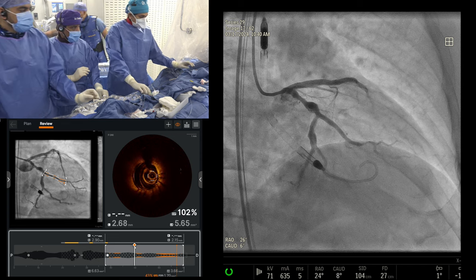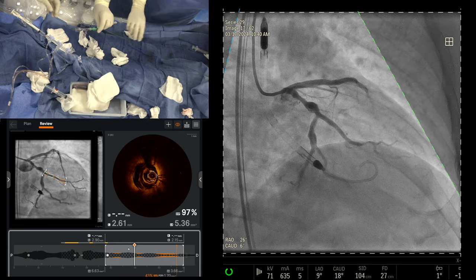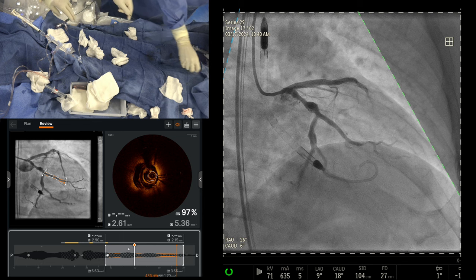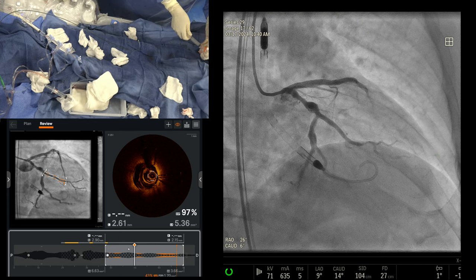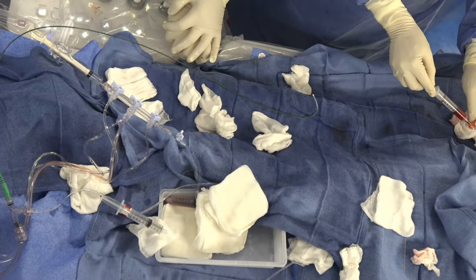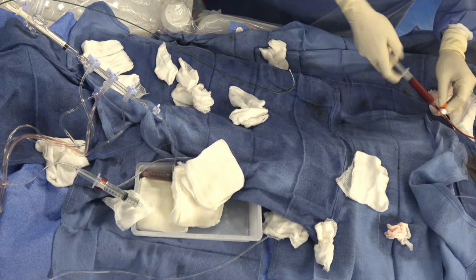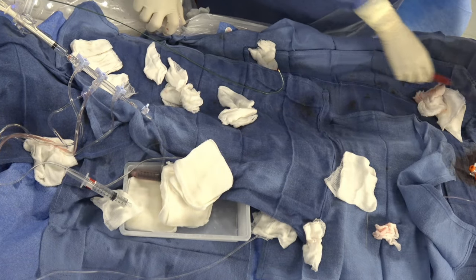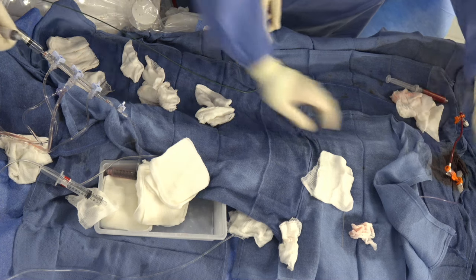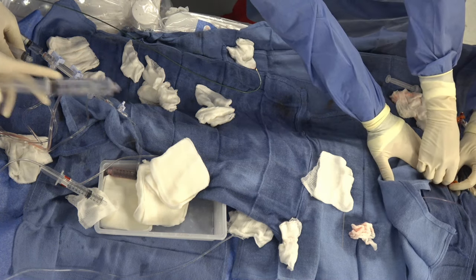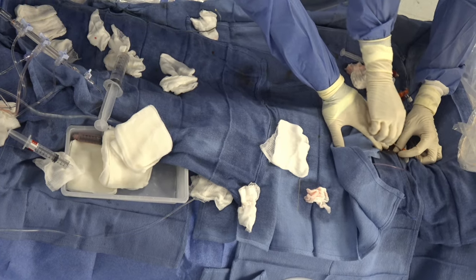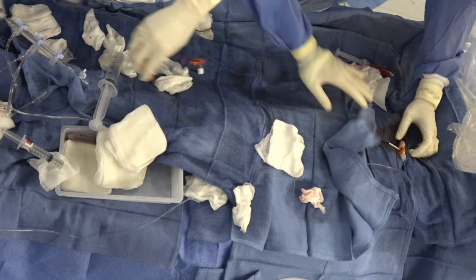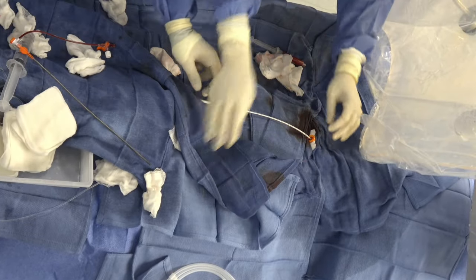Now Dr. Kenny is ready to take out the guide catheter and the Impella. First we take out the guide and sheath — sheath comes out first, then the Impella. The sheath is from a different aperture than the Impella aperture, otherwise it bleeds — we learned that very early. The sheath came out. Now we will remove the Impella. Before taking out, you want to downgrade the Impella — weaning is going on. We went from P7 to P6, then 4, waited 5-7 minutes, watched mean and systolic pressures remain stable. We're now at P2, systolic 110, mean pressure in the 70s.